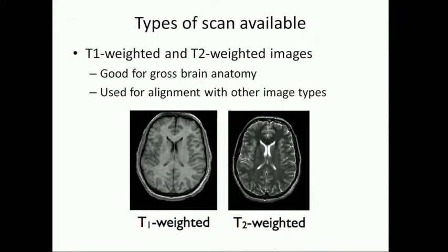Secondly, we've developed some pipelines to process those. So right now, some of your data will be pre-processed and delivered to you in a better, more processed format with basically no extra effort from you, which is also great. And thirdly, many, many other people will be using them. That means there's a community of people to call on when you want to know how to do something. It also means that you could data share in the future if you wanted to, which would also be super useful. So I think there's a lot of reasons to use these BIC standard protocols.